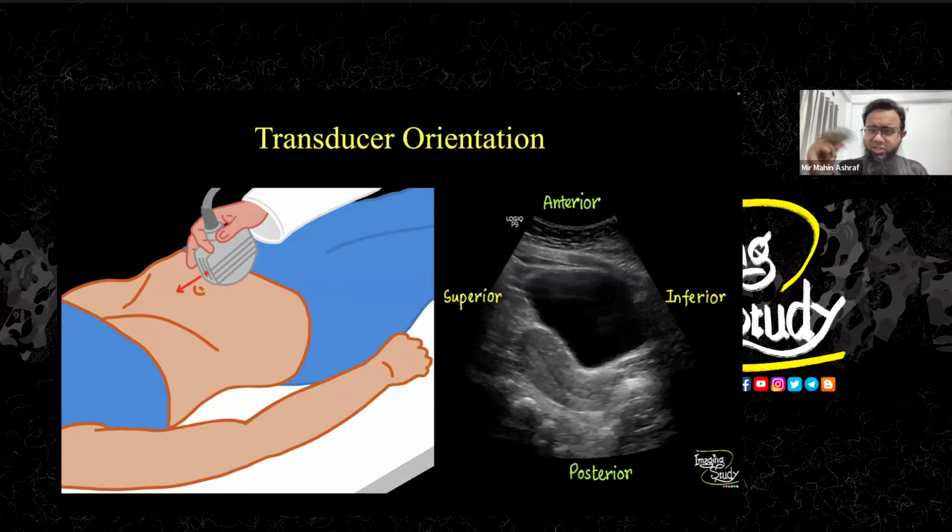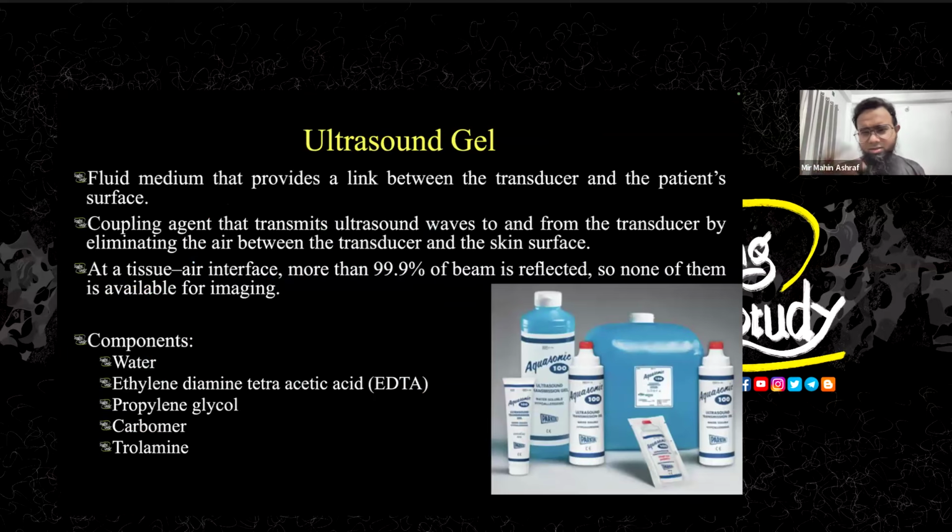So wherever you touch, wherever you hold it, depends on you, depends on your style. But the main principle is that you should understand which one is the right and which one is the left of your patient, so that you are not making any confusion. Just don't make it very much deep. It depends on you, whatever you want.